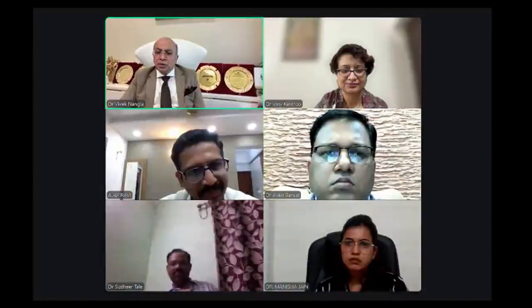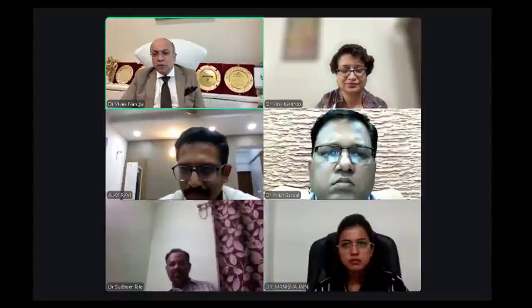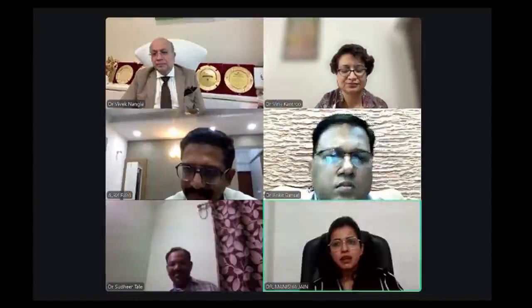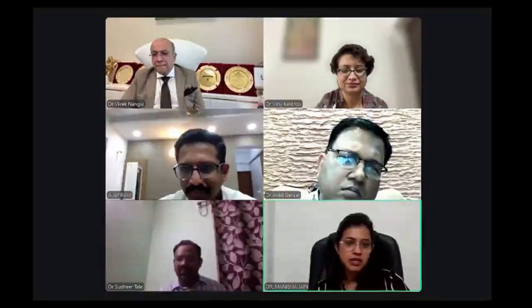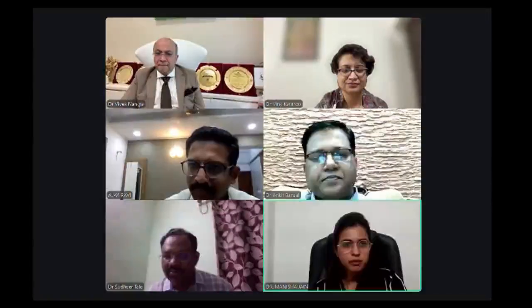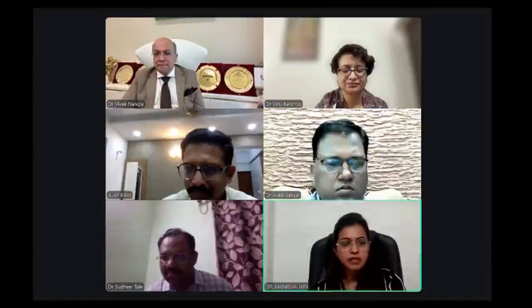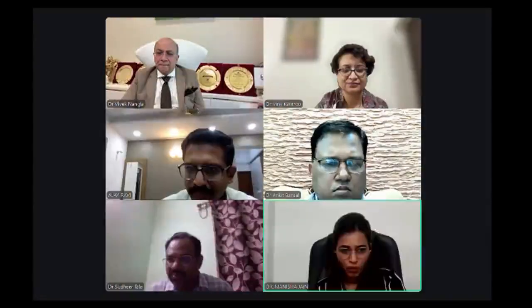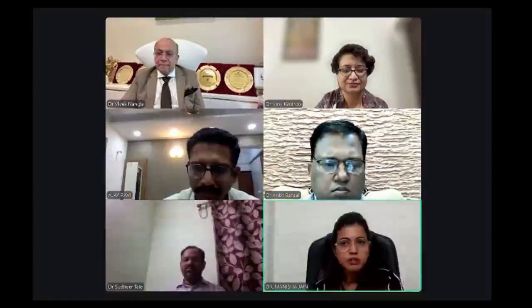Dr. Manisha, you told us about surgical lung biopsy versus TBLC, that there's not much of a difference. But Dr. Omkar, from your own town Jaipur, wants to know the advantages of TBLC over TBLB. When we compare transbronchial lung cryobiopsy with transbronchial lung biopsy, the main difference is the tissue size. The sample that we get from transbronchial lung cryobiopsy is definitely larger and well preserved. The architecture is well preserved, and there are fewer crush artifacts compared with the transbronchial lung biopsy, where the sample size is comparatively very small and a lot of crush artifacts are there. So these are the main advantages of TBLC over TBLB.